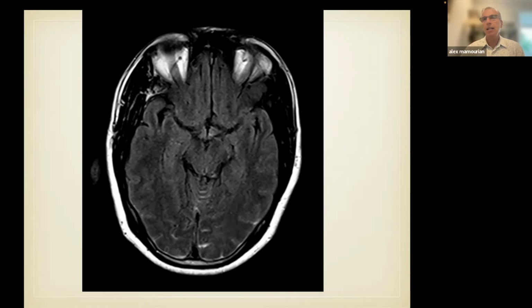Having said that, I think your question is, will subarachnoid blood alter the appearance on diffusion imaging, susceptibility weighted imaging, or shallow flip angle gradient imaging? My answer is no. I find that it's unreliable. I've seen a lot of cases where I'm tempted to say it's not blood based on the lack of susceptibility effect on SWI, but in fact it is.